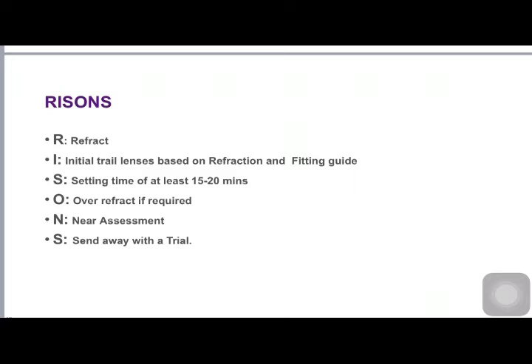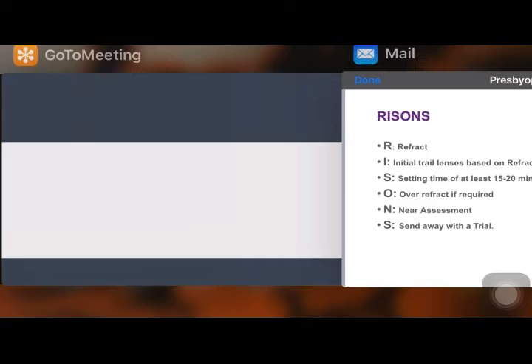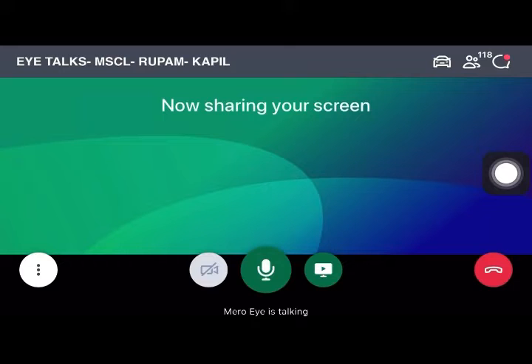Yes, sir. There is a question from Sadbab. Is there any problem in the patient using the multifocal contact lens in a different light environment due to pupil reaction? What are the accurate room light conditions to check the pupil with the multifocal contact lens?